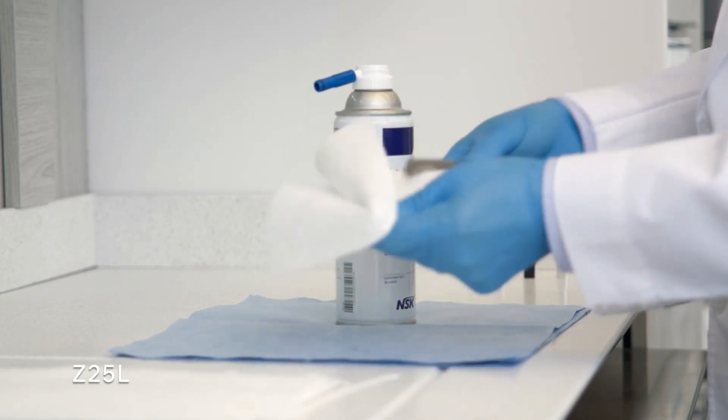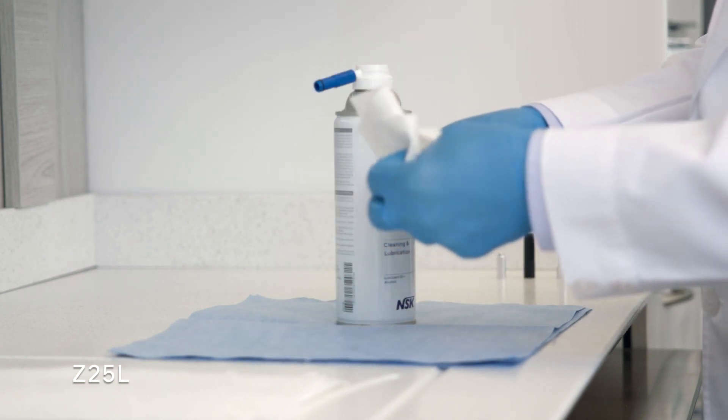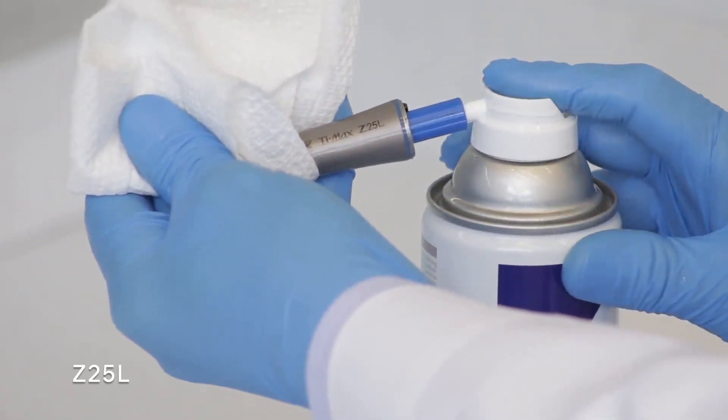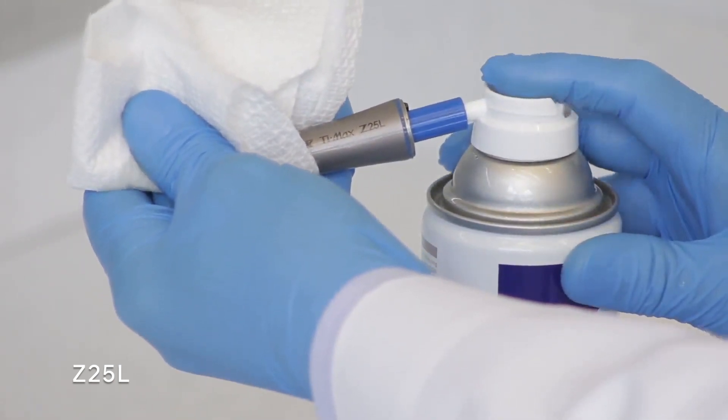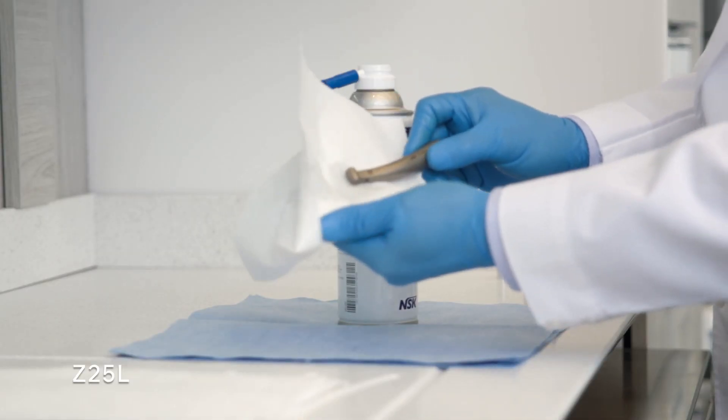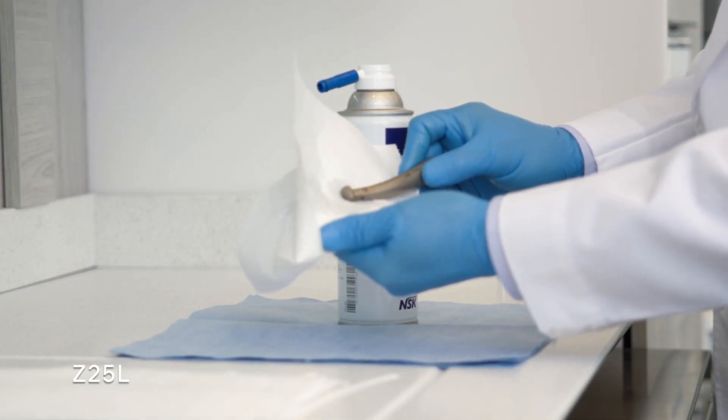Cover the head properly using a paper towel. Insert the nozzle to the back of the attachment all the way in, and spray for two to three seconds until the clear oil comes out of the head. If you notice black debris coming out of the head, repeat this process again until the discharged oil is completely clear.